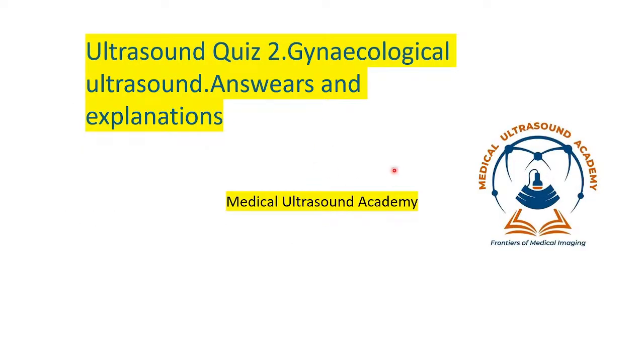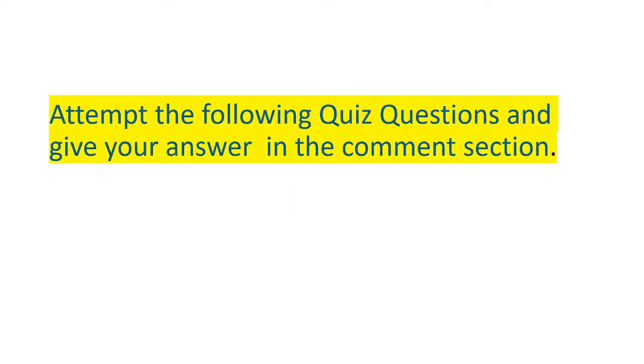Hello, good people, and how are you? So now, let's discuss the answers to our ultrasound quiz 2, gynecological ultrasound. So I will give you answers and explanations to the questions that I gave you.